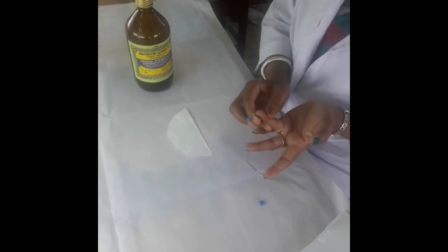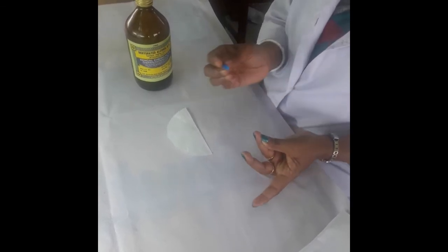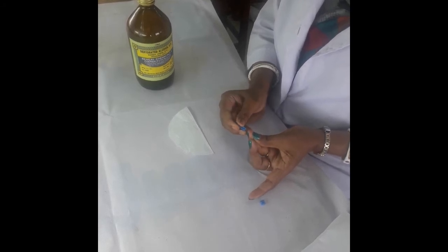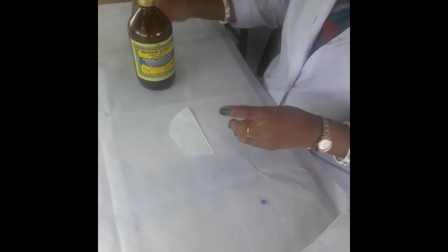Actually, bleeding time is done in the ear lobe. The finger is pricked and every 30 seconds the blood spot is noted. I am going to prick now and record the first drop.